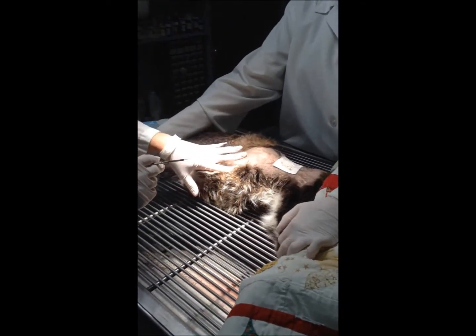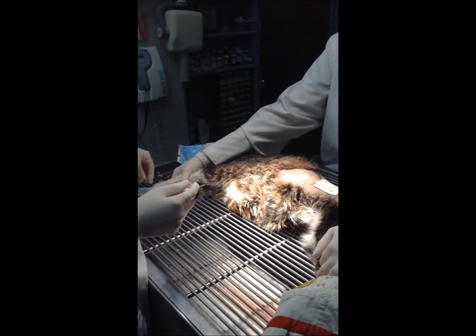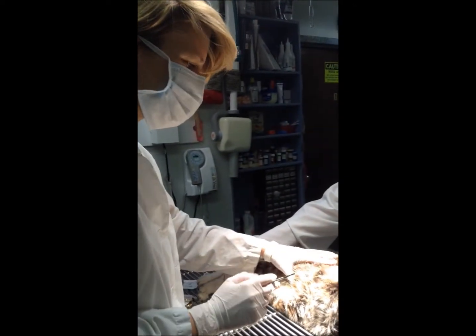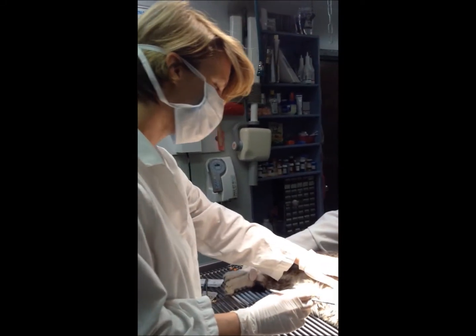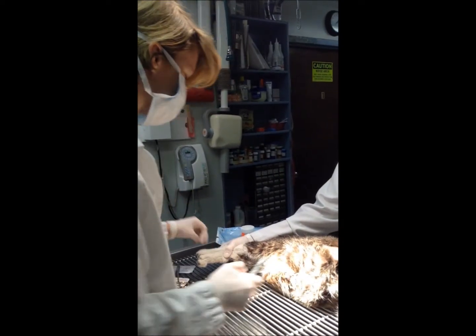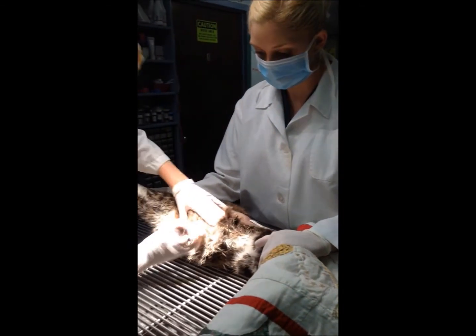Okay, we're going to do a short necropsy on the cat. A 15-year-old cat that presented for diabetes and non-healing wounds. We were suspicious of Cushing's disease, so we're just going to try to take a look at the adrenal glands in this cat. Christy's helping you. We're just going to position her a little bit different.